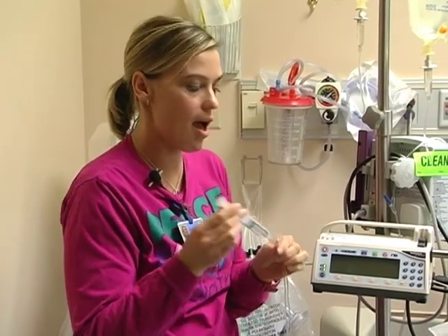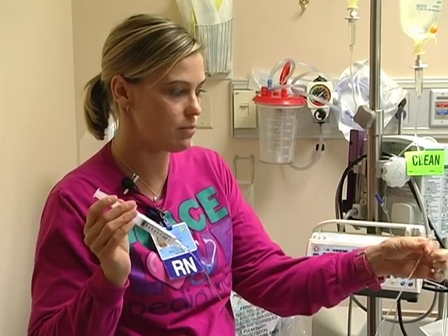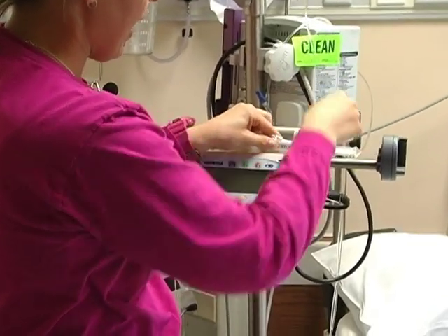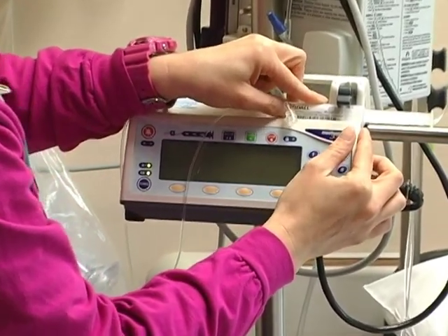You're going to start by having your antibiotic and priming your syringe pump tubing, which is found on the PARE. You are going to place your syringe and you're going to want to make sure that the flange is in this portion of the pump.